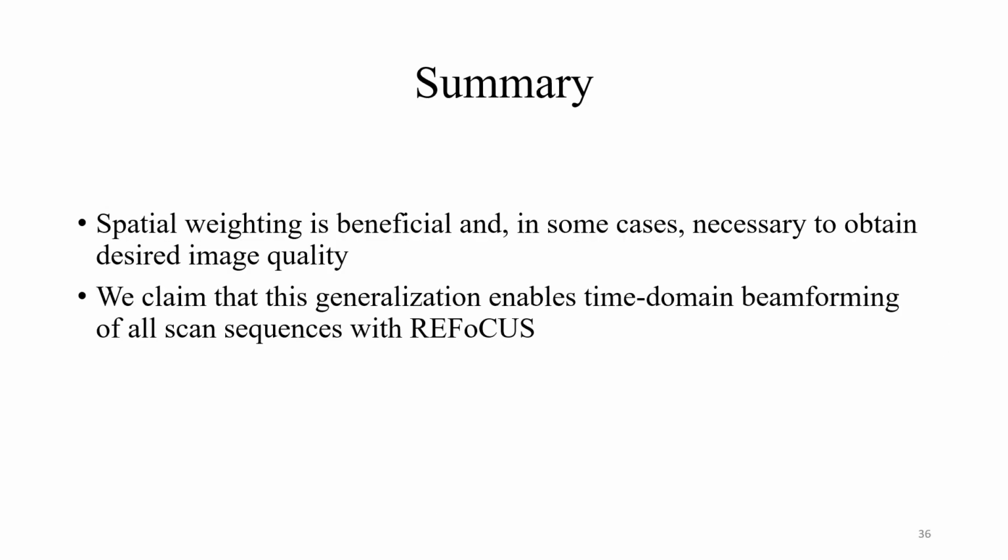In summary, we have demonstrated that spatial weighting is beneficial and in some cases necessary to obtain desired image quality when using REFoCUS. We claim that the generalization shown here enables time domain beamforming of all scan sequences with REFoCUS.